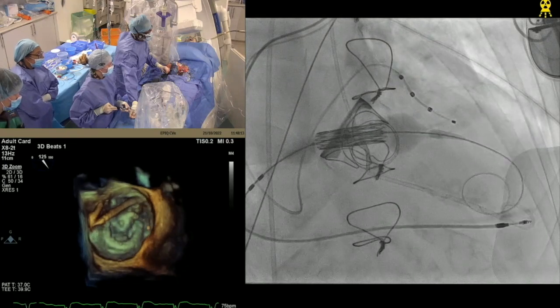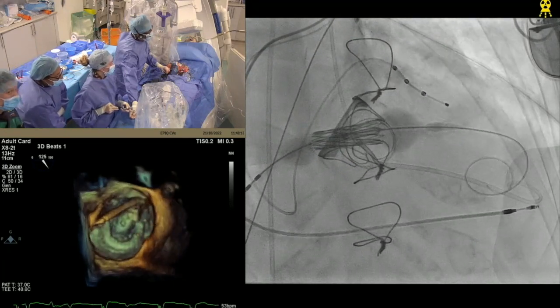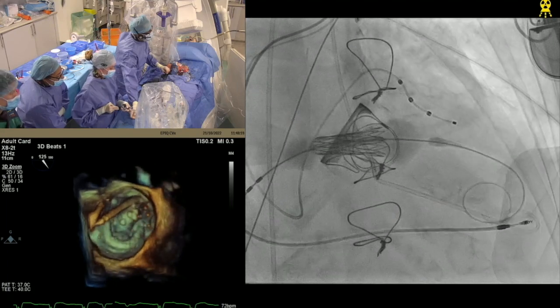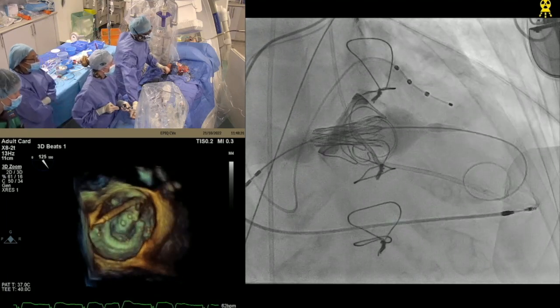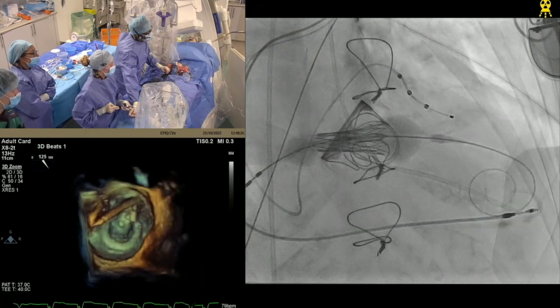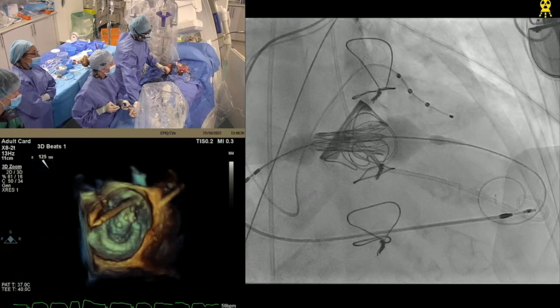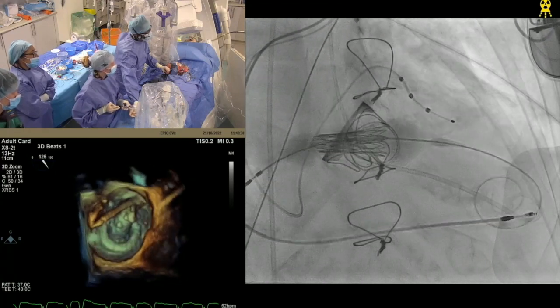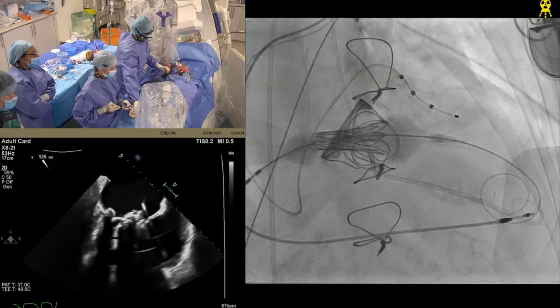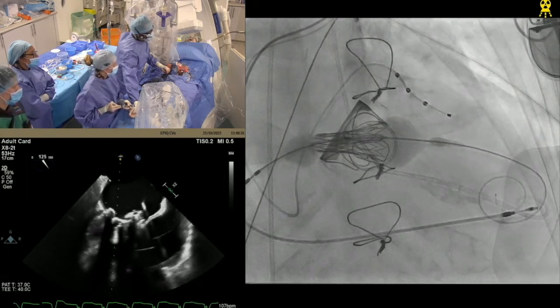Positioning it again, I'm pushing in a little bit, tiny bit more, hold there. So we can still probably move it a little bit. I'm pushing it in now. So I'm pushing the wire in a bit, pushing it inwards. It's beginning to inflate. Now another mil. It's straightening. Okay, now it's probably a bit too low.